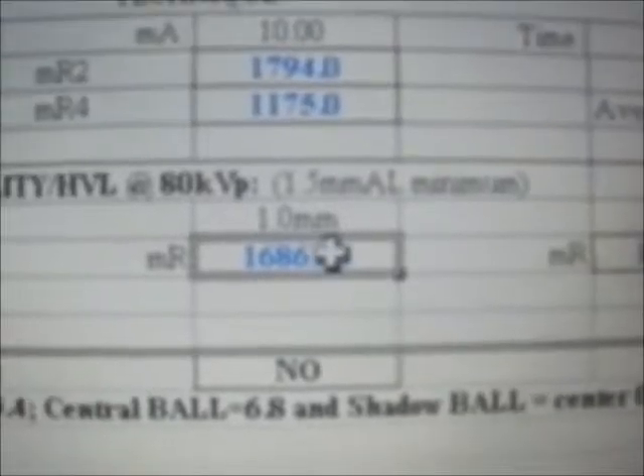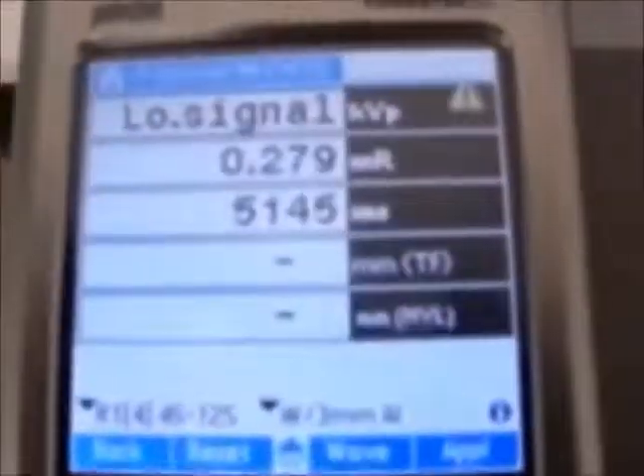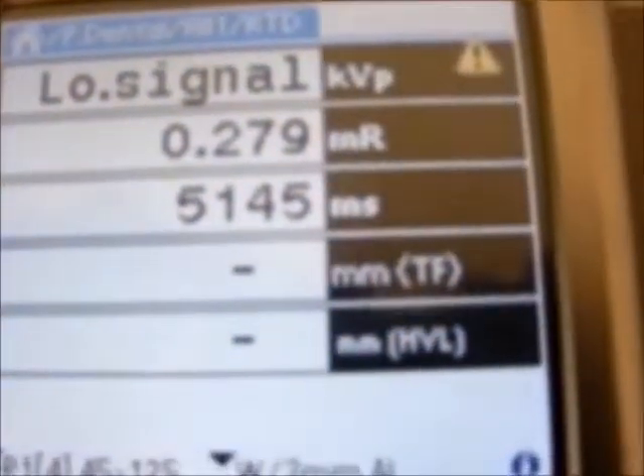Then we enter one millimeter of aluminum in its place. As you can see, one millimeter. I've now set up one millimeter of aluminum within the beam. This is our x-ray QA device. Set the same technique: 70, 10, 5. Press test, press the green button, take a shot. Record our measurements. At one millimeter, we're reading 0.279.